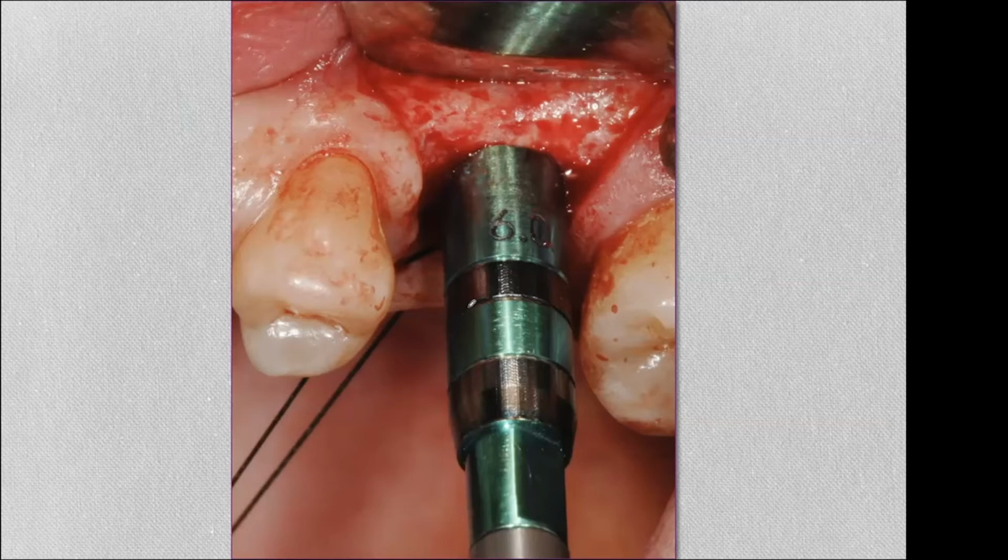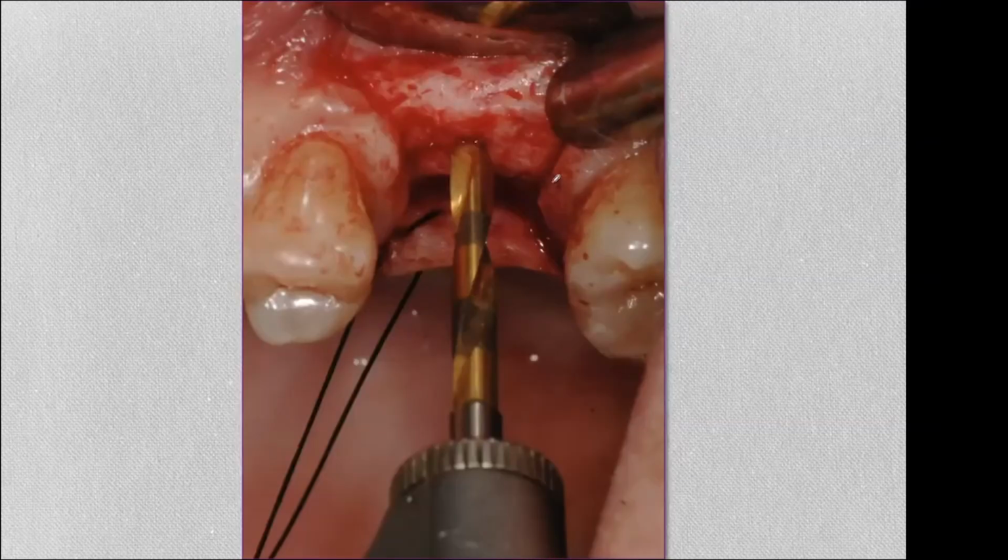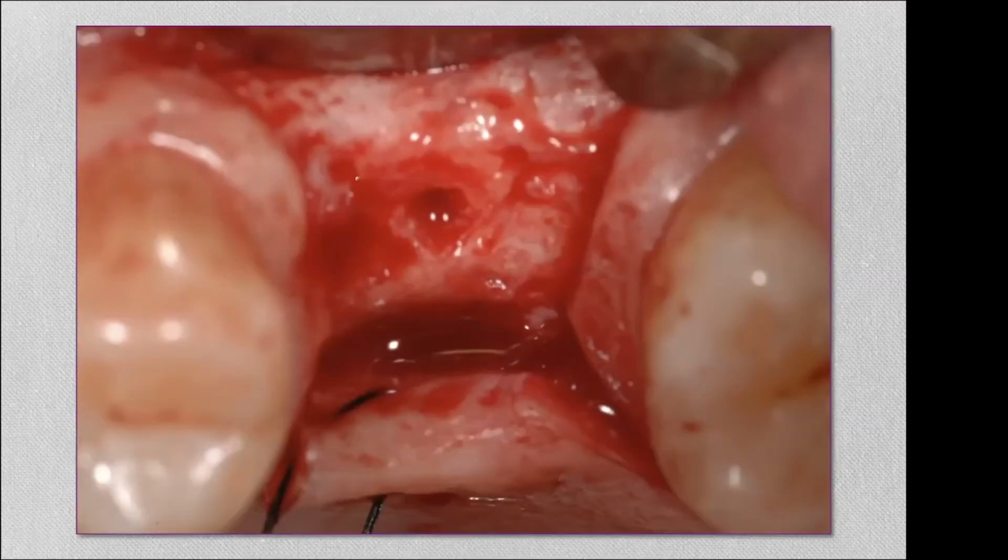I'm not lifting the sinus yet, but what I am doing is seeing where a 6 millimeter abutment, because that's the recommended abutment for a molar, would emerge. Does it emerge with good room for the papillae? And it shows plenty of space. Okay. And then I can make a mark with this edge as to where the mesial edge of it is. And then using my pilot drill, I will just mark the center of where the implant has to go. That's roughly a millimeter or two deep, which I can then check. Okay. See the little notch from the osteotome and the marking.